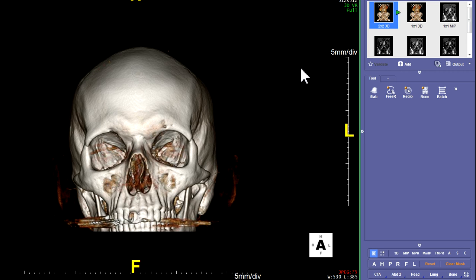Hello, this is my video part two where I'm going to show you how to use TerraRecon to make COW reconstructions from CT angiograms of the head.